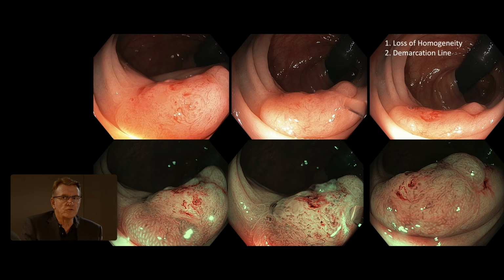But there's a proportion where, even if the tattoo is done in the right spot, there can be sublesional diffusion of tattoo, and the sterile carbon particle suspension is not biologically inert. It's sterile but it creates fibrosis. So if you want to make the endoscopist's life very difficult, you tattoo underneath. Not very, but more difficult. Well, I would say very. Anyway, so we have the two extremes.